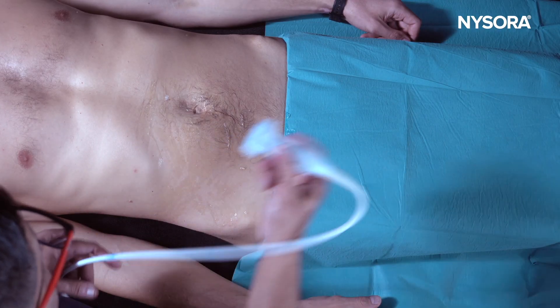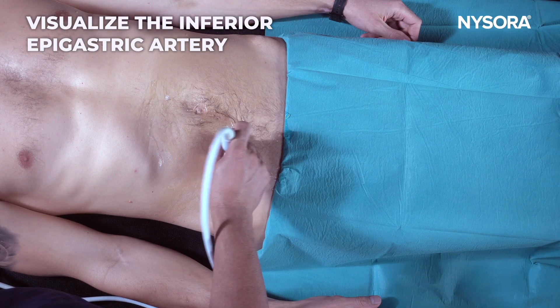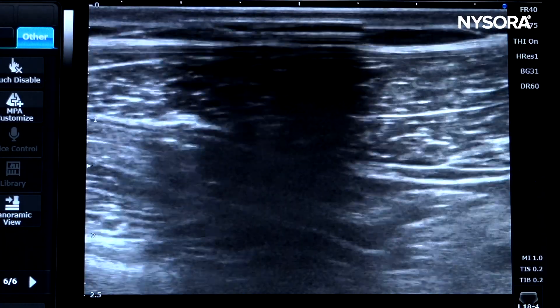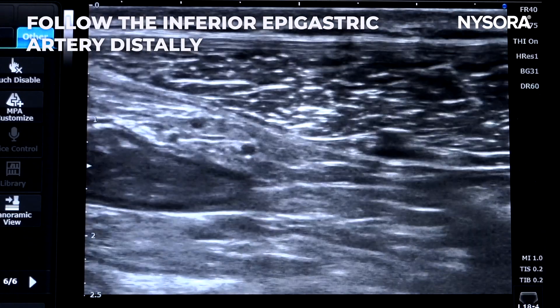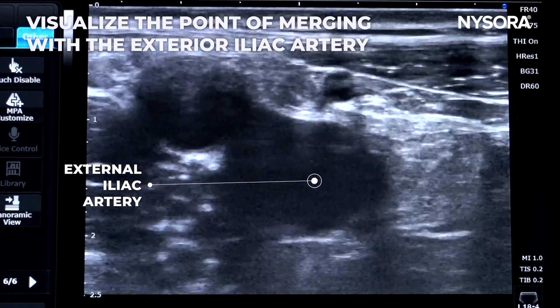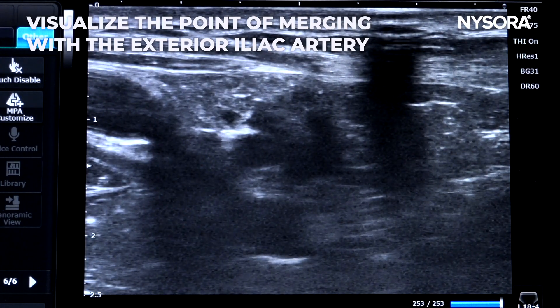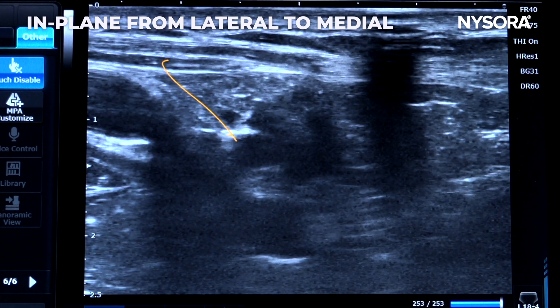The second technique for scanning the genitofemoral nerve involves looking for the inferior epigastric artery. In this image, we have the rectus muscle along with the inferior epigastric artery. You then follow and scan the inferior epigastric artery distally, looking for its merging into the external iliac artery. Where it joins the external iliac artery is the structure where you will find the genital branch of the genitofemoral nerve, which can be blocked using an in-plane technique coming from lateral to medial.